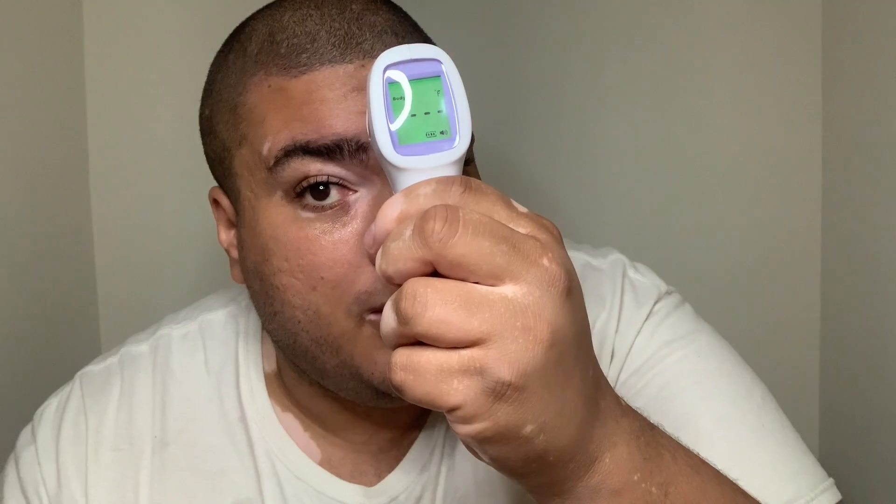The only thing that really worked was the face rubbing. I am bamboozled here. These things are pretty solid — there's no tricking these. You're screwed. I guess you're just going to have to fake a fever the traditional way.